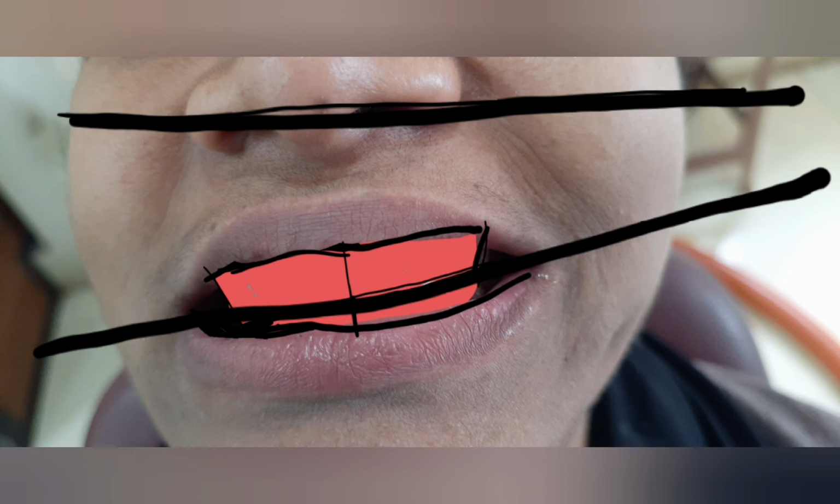So, it is important that we ask the patient to be seated properly, head in the right position, and stand back right in front of the patient, and view straight.